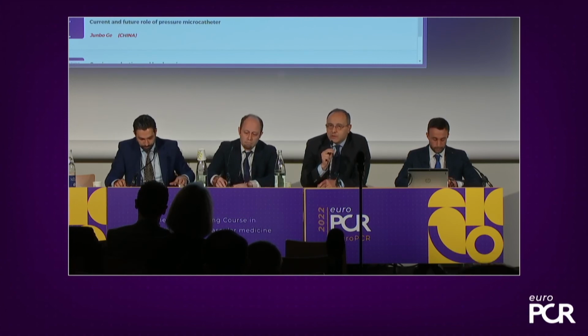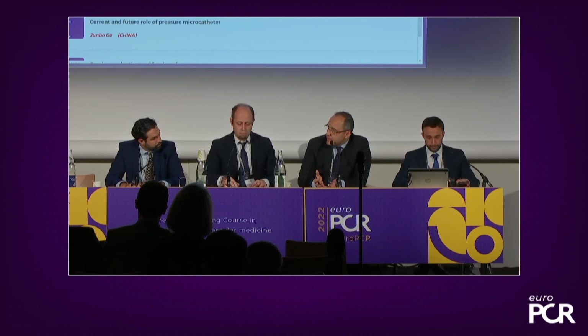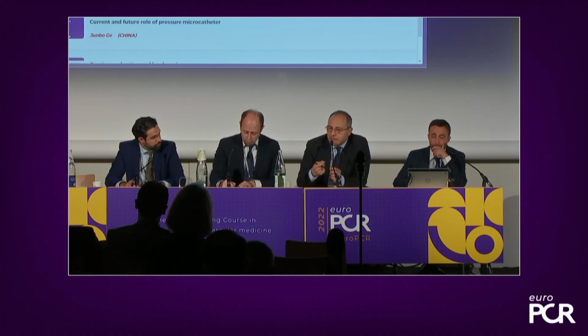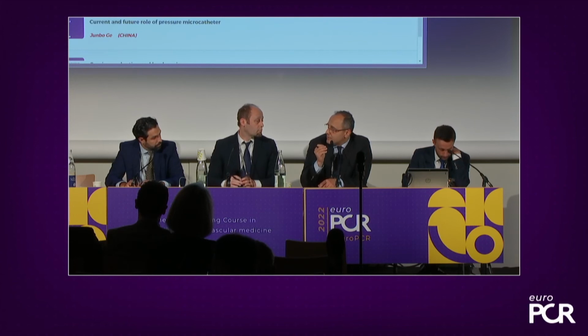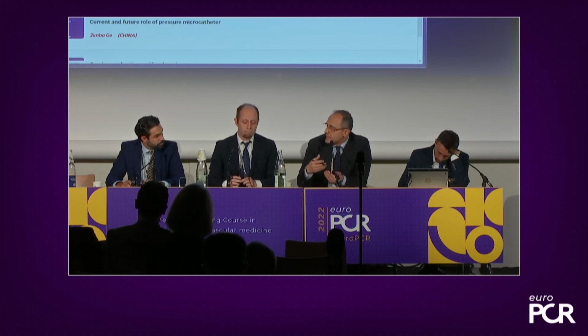It is. It doesn't only look, it is easy actually, and that's the advantage of working with your workhorse wire, which is, like any wire you are confident to use, and the fact of having a pressure microcatheter that you can slide on each time you want and in the very moment you need during the procedure, preserving it from a possible stretch or stress that you can provoke when doing balloon dilatation, stent implantation. This is what can often happen to the pressure wire.